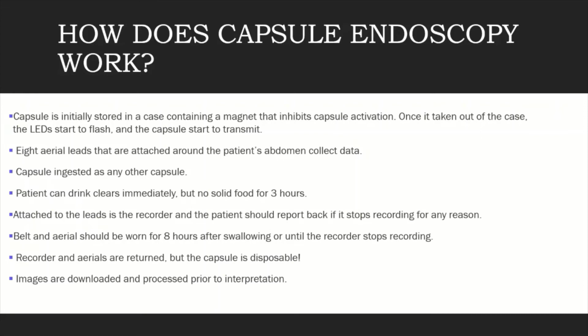The recorder and aerial are returned, but the capsule is disposable. Images are downloaded and processed prior to interpretation.